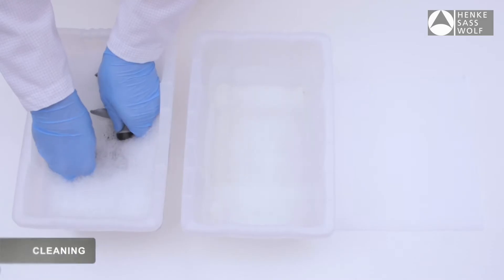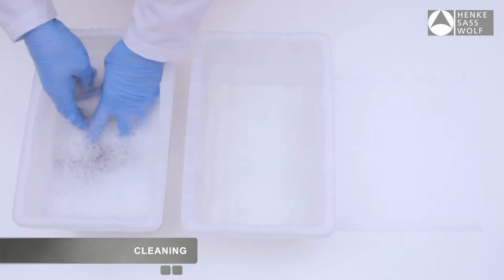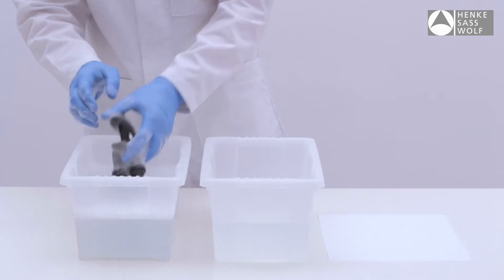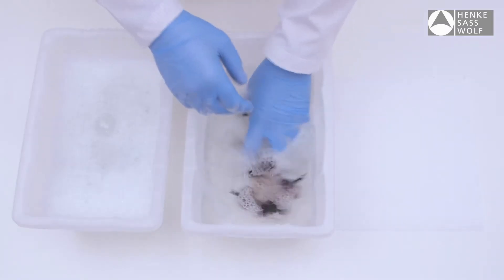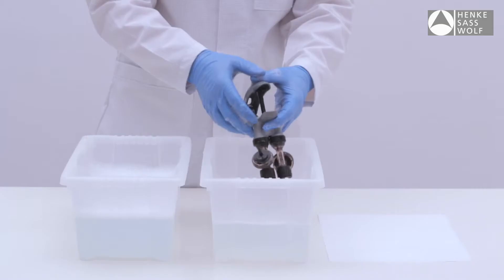Remove all traces of material from the syringe by flushing thoroughly with a hot water detergent mix. Rinse thoroughly with clean, warm water. It is recommended that the Eco-Matic Twin and a supply of needles or nozzles be disinfected before and after each use.